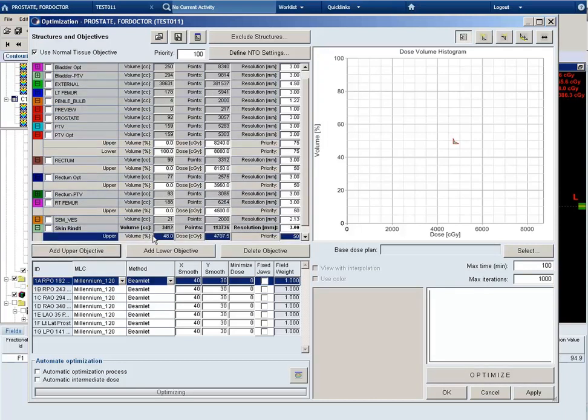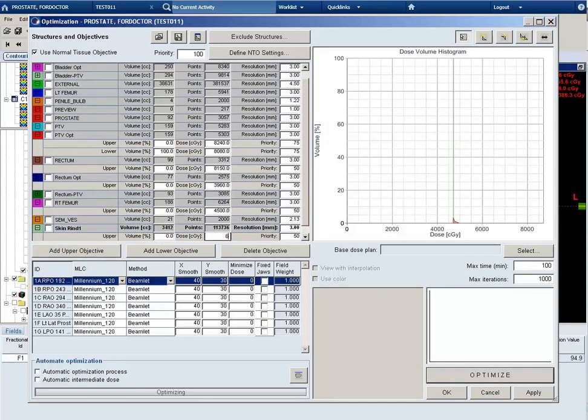I'm going to go ahead and put an upper constraint on the skin rind. Select the dose of 60 gray and a priority of 60.